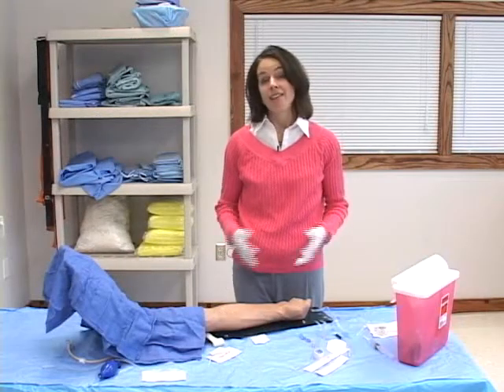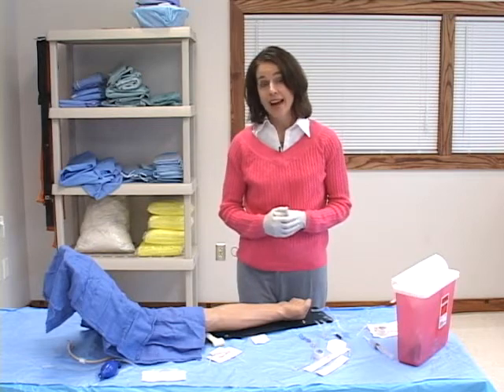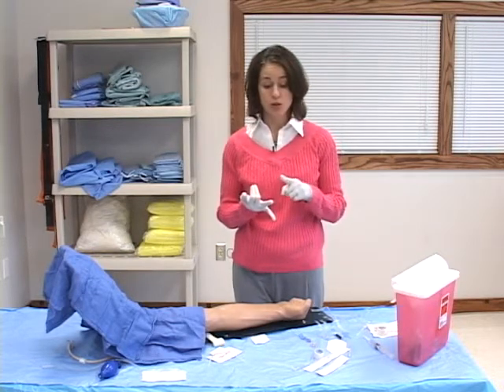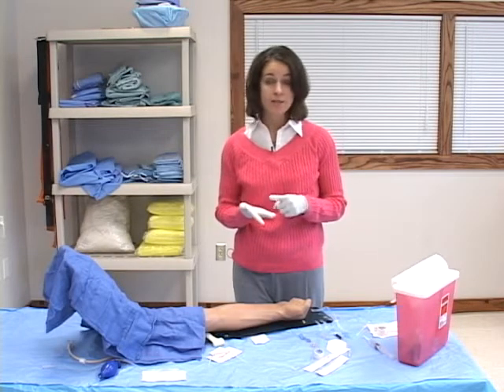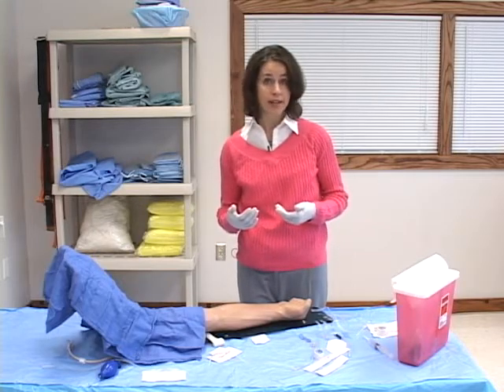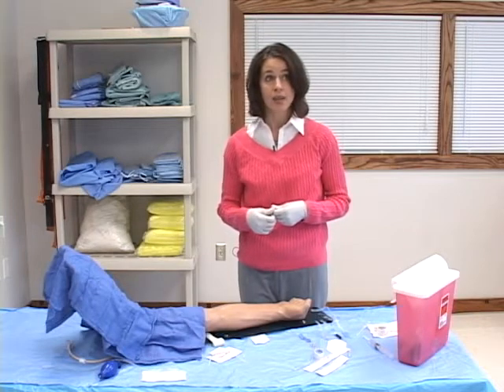This is a video on how to start an IV. Starting an IV is a critical skill for a physician to have in order to administer IV medications, to administer blood products, or to administer IV fluids. And often the physician is going to be the one who is called after there's been multiple attempts at starting an IV. So a physician needs to be skilled in starting an IV.